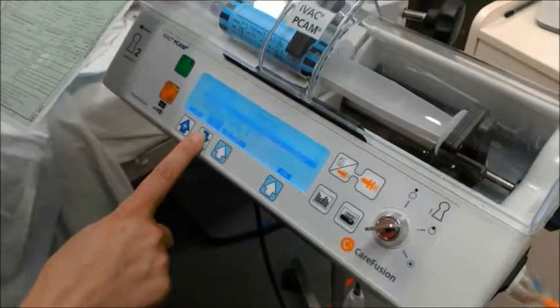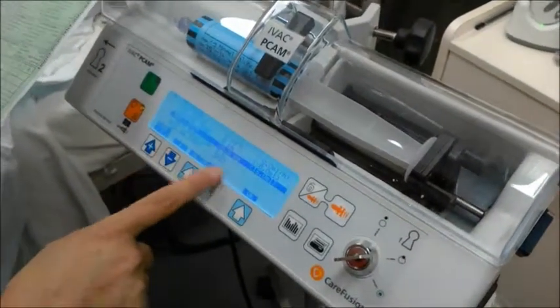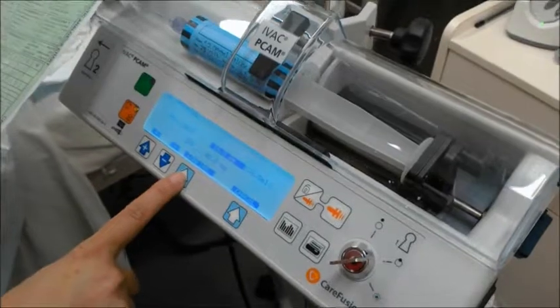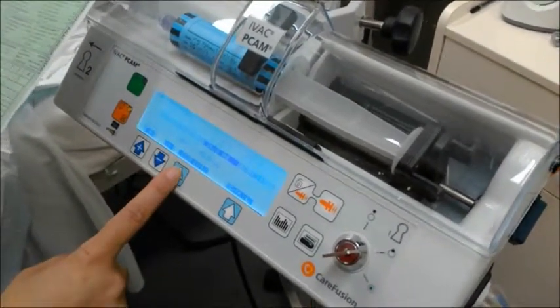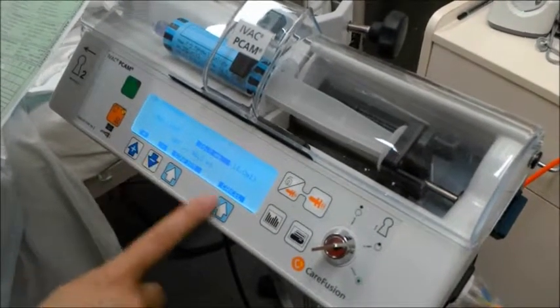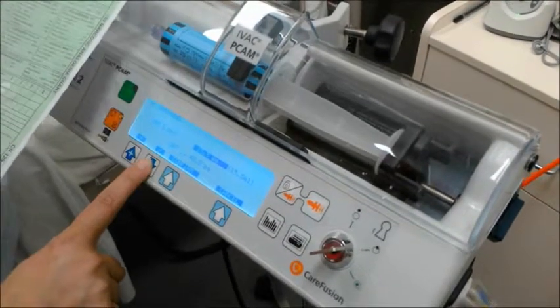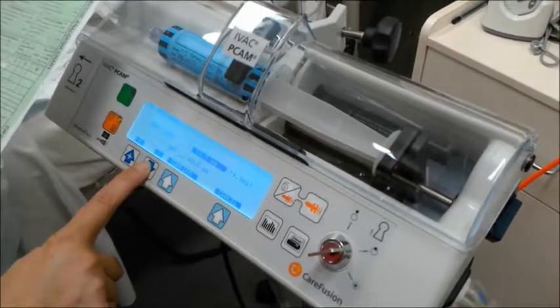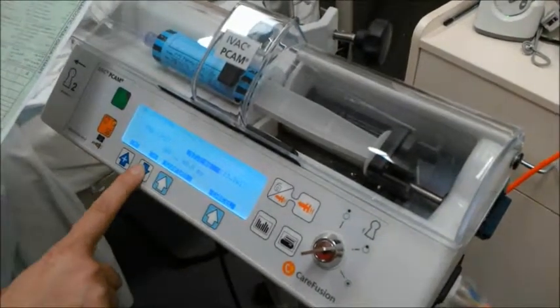Lockout 5 minutes. Hourly dose limit is 12 mg, so I'm just going to change it to 12 mg.